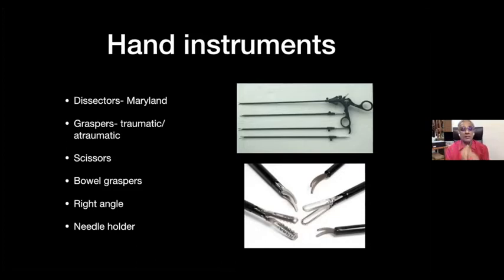So you must have at least basic instruments in all sizes. If not, better not to do it, or try to get the company to lend you some of the longer instruments. So this is very important. Hand instruments, don't take them for granted. Know what you have. Take care of them well so that they will last you long.